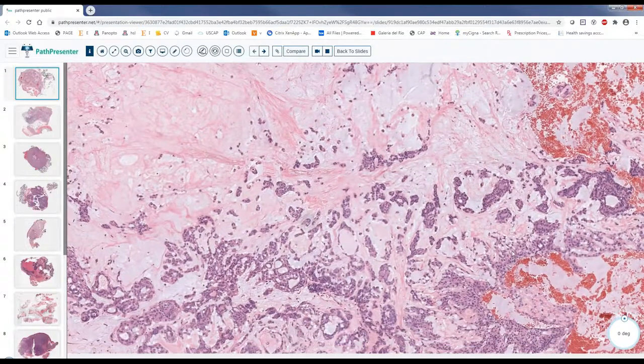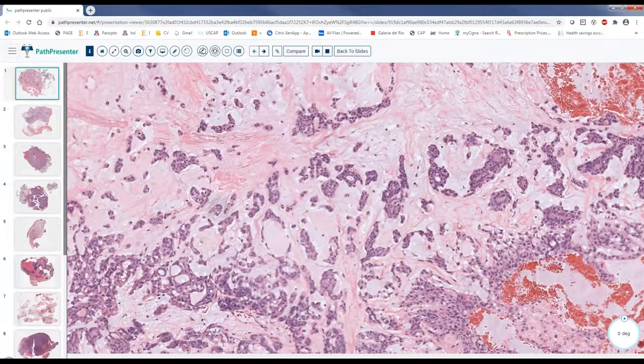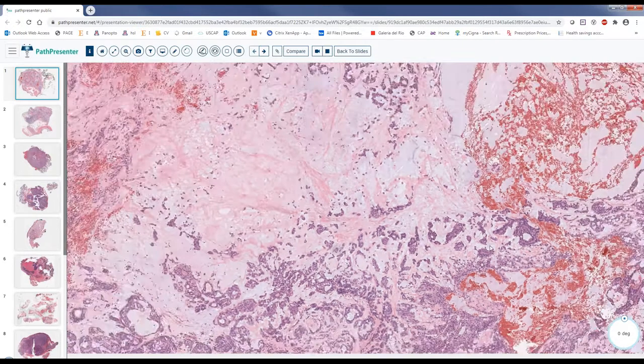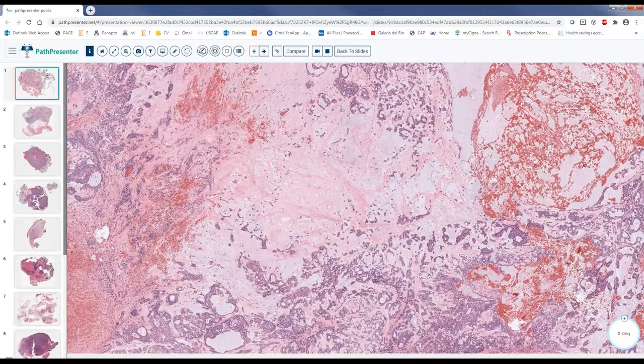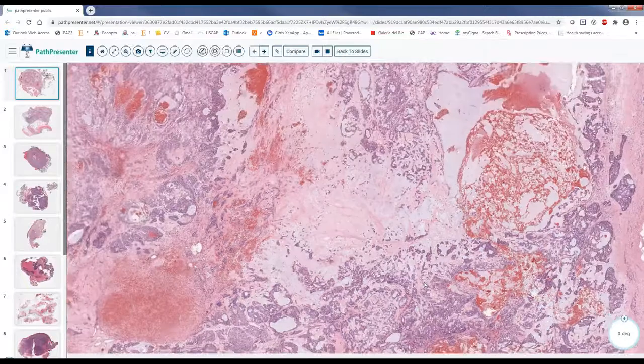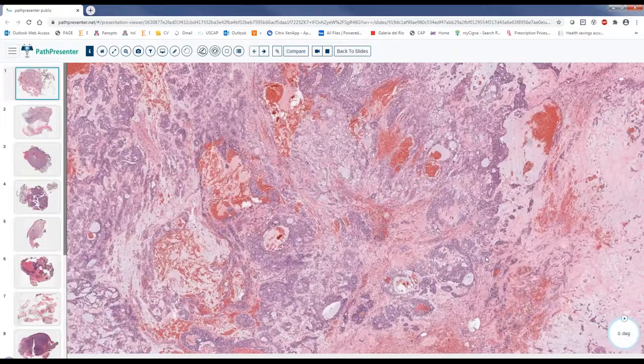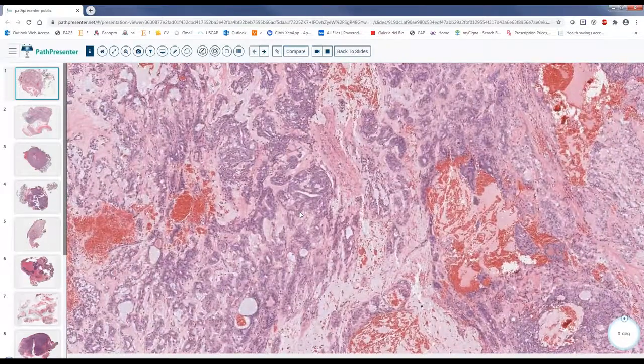The other component is the ductal area, and also the myoepithelial area. So these are the two usual components of this lesion. I'm sure by now everybody gets to the diagnosis. This is a pleomorphic adenoma, or the other word is benign mixed tumor, based on the components that are there. I think this is an easy diagnosis. Everybody has seen the cytology, then we go to the histopathology. It's easier to grasp. Boom.